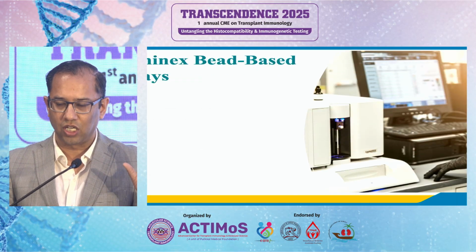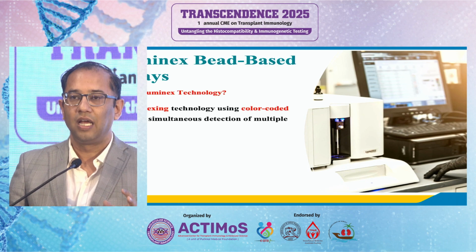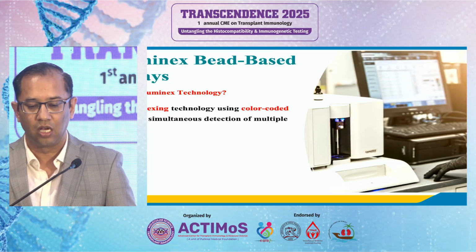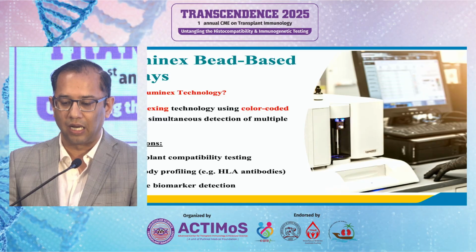This is just a brief about the Luminex-based assay. What is Luminex technology? It is like a glorified flow cytometer. It is a multiplexing technology using color-coded beads for simultaneous detection of multiple analytes.